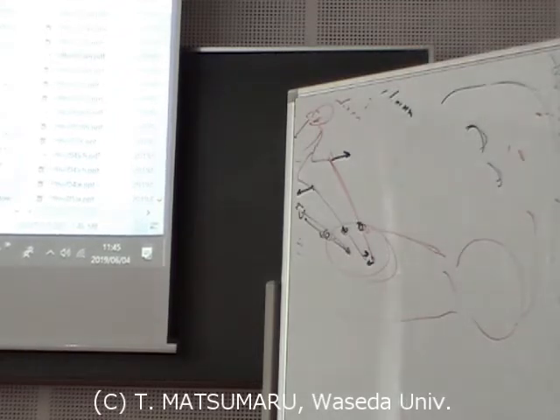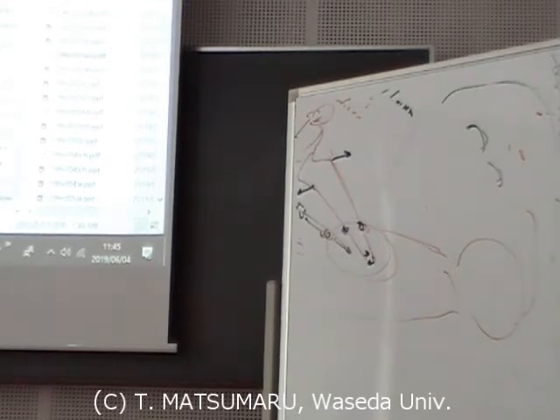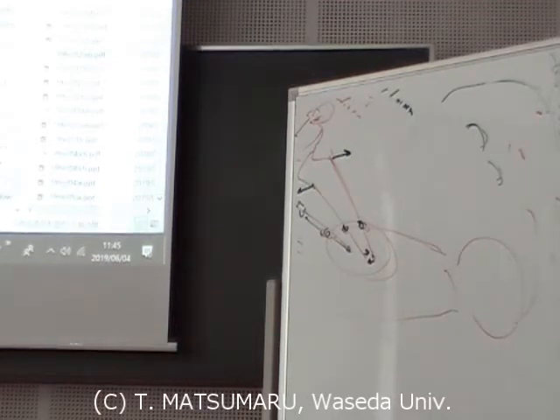Next, the laparoscopic robot is a surgical robot. The Da Vinci system was proposed in 1999. It was shown before starting this class today. There is a surgeon console. Stereo vision is presented to the surgeon, and both hands operate the operating arms.